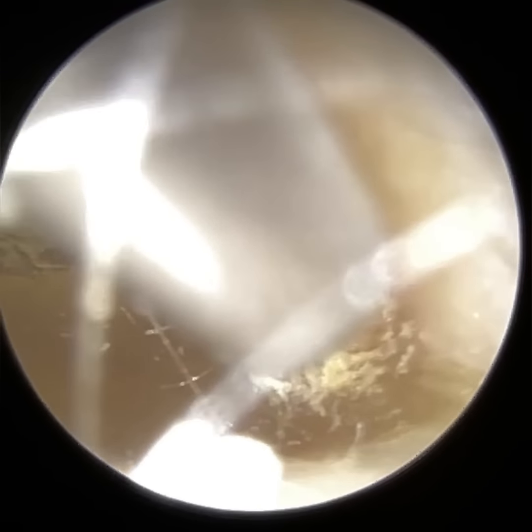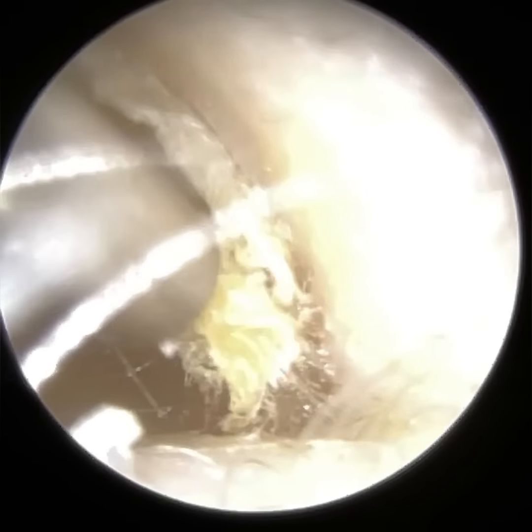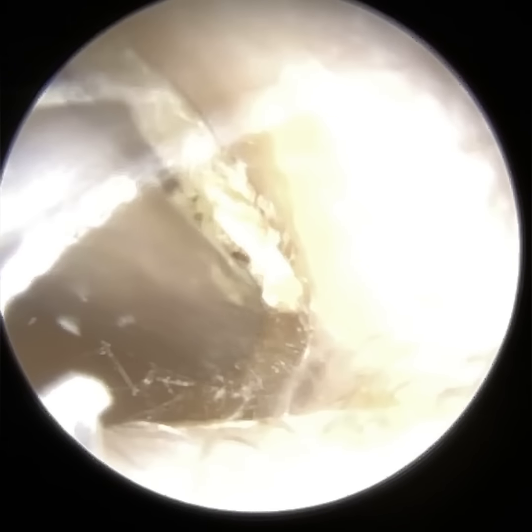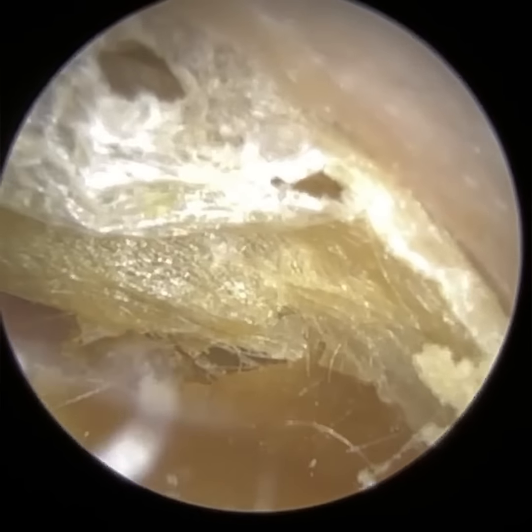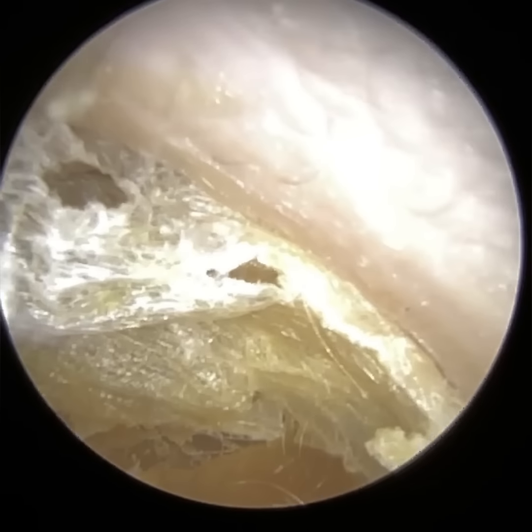Just with the right side, so again, dead skin, it's all keratin, there's no wax here. I'm going to use a combination of suction and also a forceps. So interestingly, this patient, I think many years ago I uploaded a video, and I'm pretty sure it's the same patient now that I'm thinking about it.